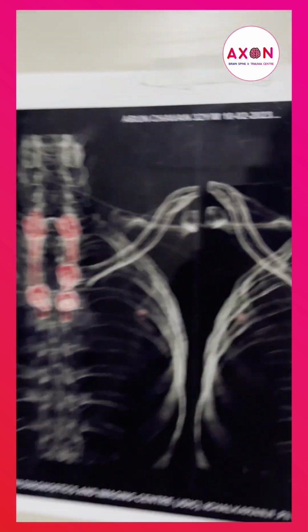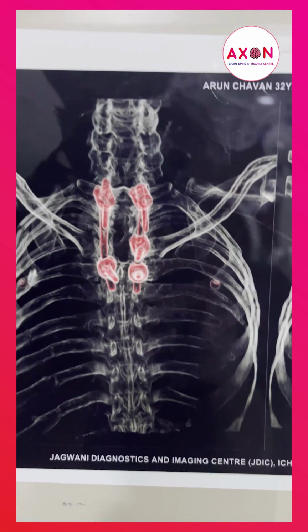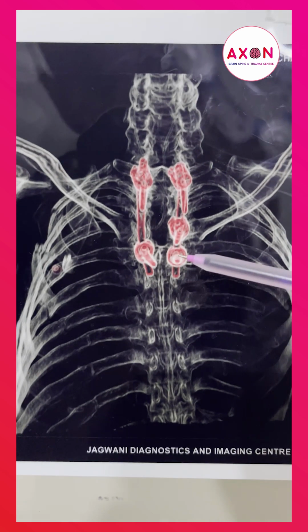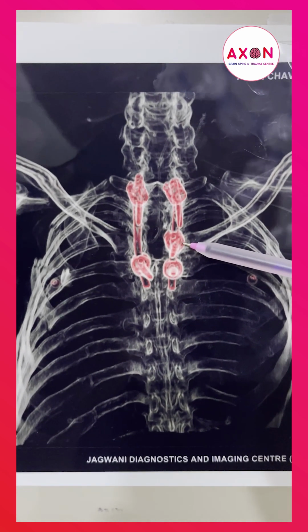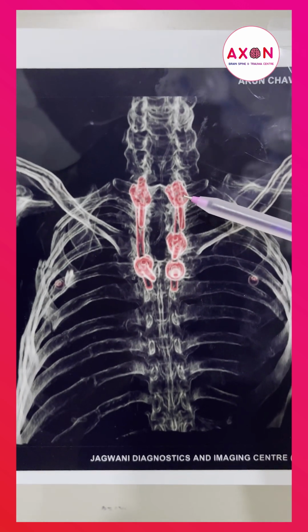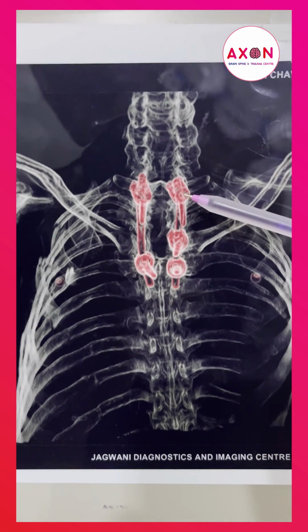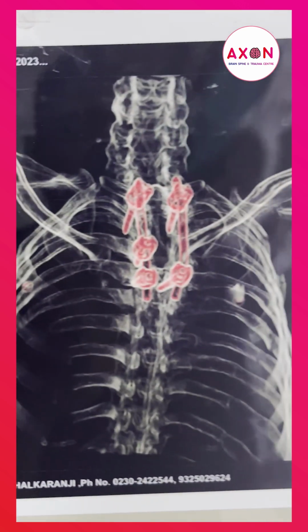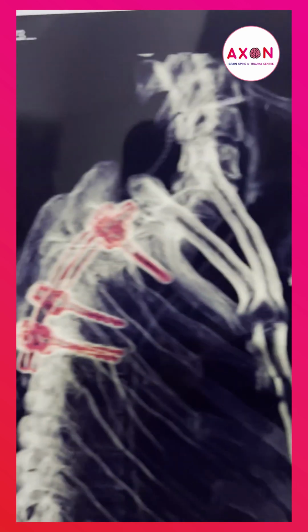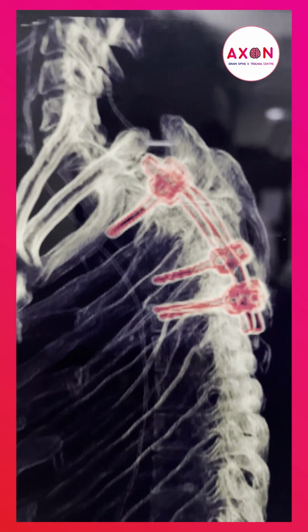So we have operated on this patient, and as I previously said, this is the post-operative CT scan. We have done a 3D reconstruction of the post-operative CT scan. You can see I put screws bilaterally in D5, unilaterally on the right side in D4, and on D3 I couldn't put a screw because the spinous process was fractured at the base. On the D2 vertebra I put bilateral screws. This is the 3D reconstruction AP view.